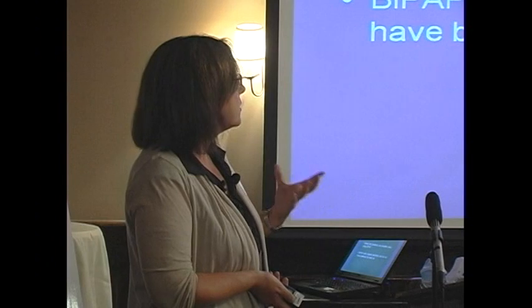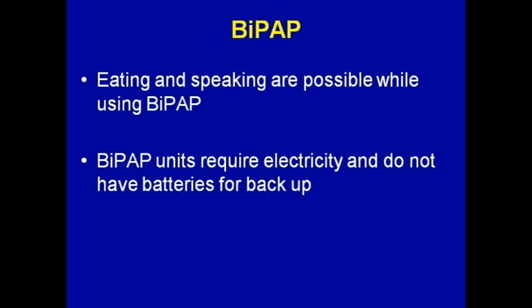Most BiPAP units require a plug. It's not considered life support. It doesn't take over. It's the rare BiPAP unit that has batteries for backup, so they're not terribly portable. This is something that may be changing with technology, but the majority of units really don't have battery backup.